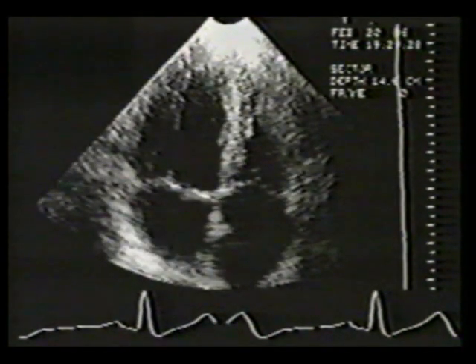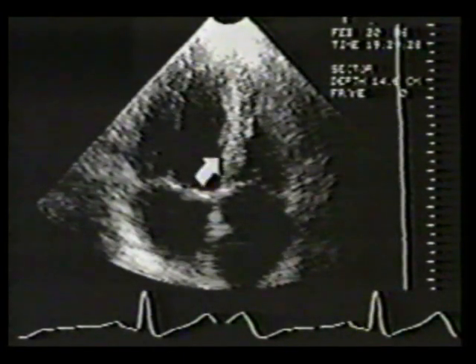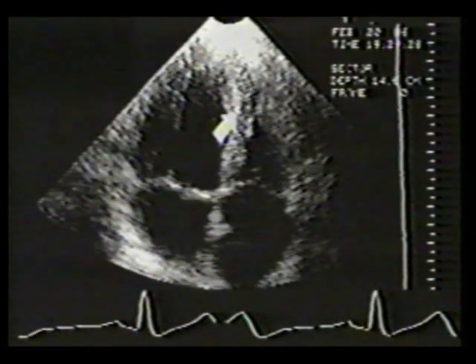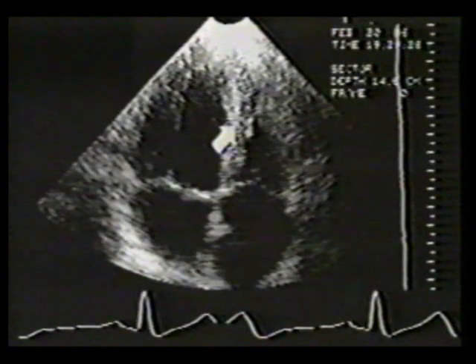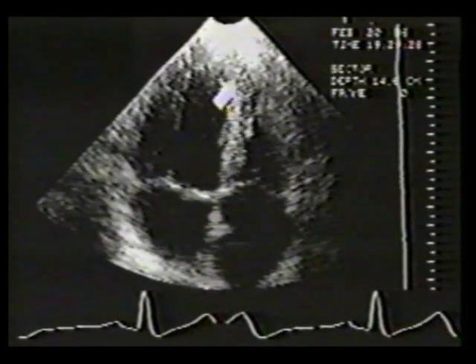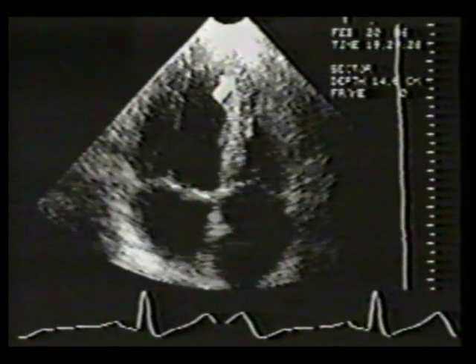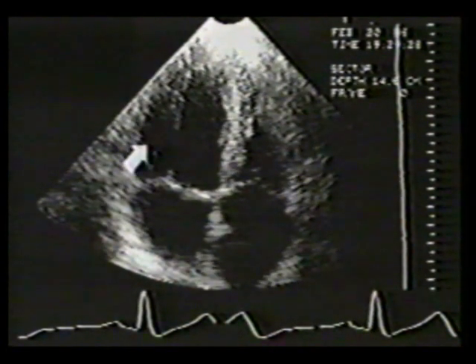The image has been expanded. In the apical four-chamber view, we are imaging the inferior septum at the basal and mid-ventricular levels. This portion of the septum is supplied by septal perforators from the dominant coronary artery on the inferior surface of the heart. This is the apical septum, which is supplied by the left anterior descending coronary artery. The lateral wall of the left ventricle is usually supplied by the circumflex coronary artery.